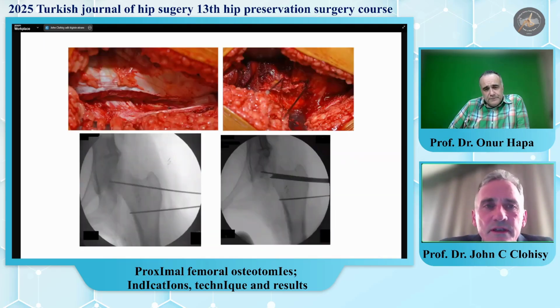Here she is at the time of the osteotomy. So we did the scope, we repaired the labrum. She had an anterior labral tear. We're in the lateral position. The head is on your right, the foot is on your left.